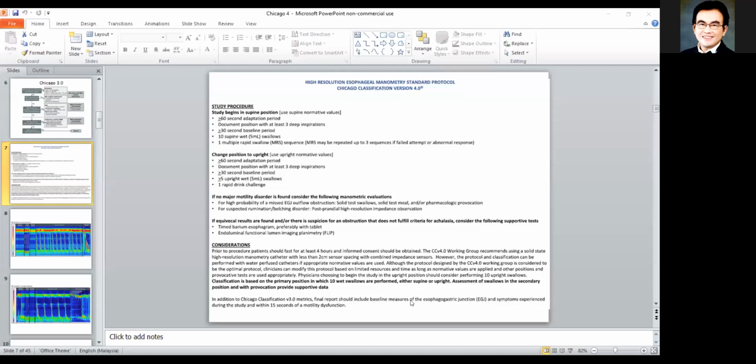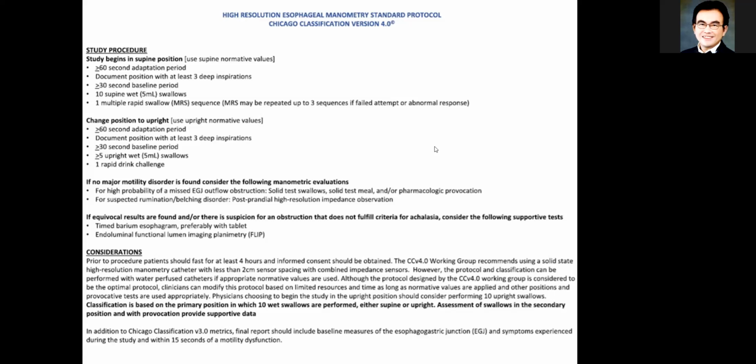Although most of the units nowadays are already moving towards solid state catheters. And if you are already using solid state, we tend to do the upright position already, isn't it? In which case, if you do an upright, at the end, Pei On mentioned, they do suggest to do a rapid drink challenge.